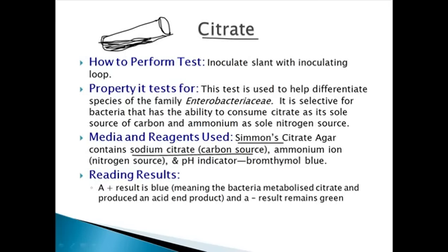The production of their byproducts will react with the ammonium ion which is present there and form a different coloration, as you know. It also has a pH indicator, bromothymol blue. So what does it mean? The pH indicator bromothymol blue will turn blue and green, or between blue and green color, in all the steps.